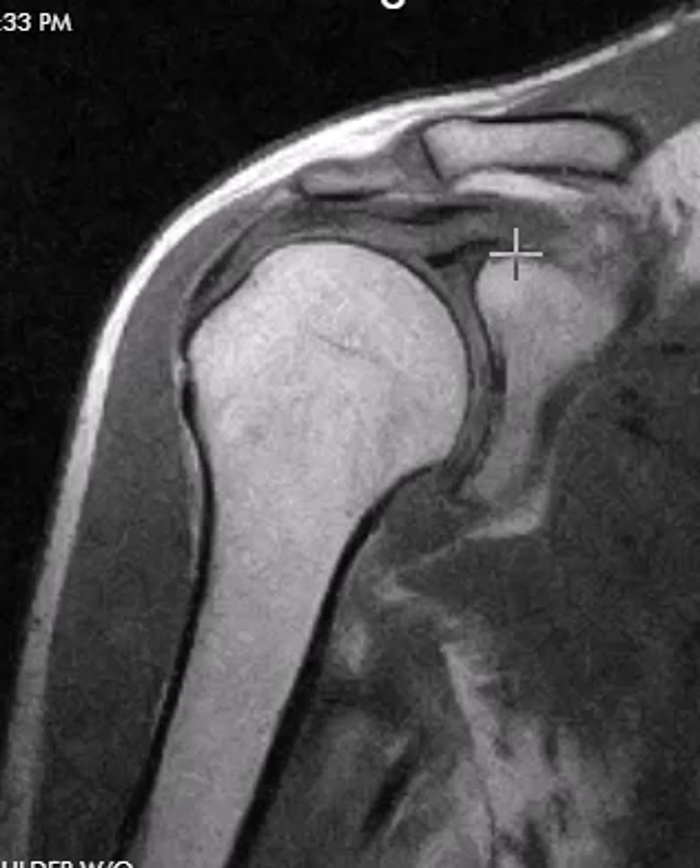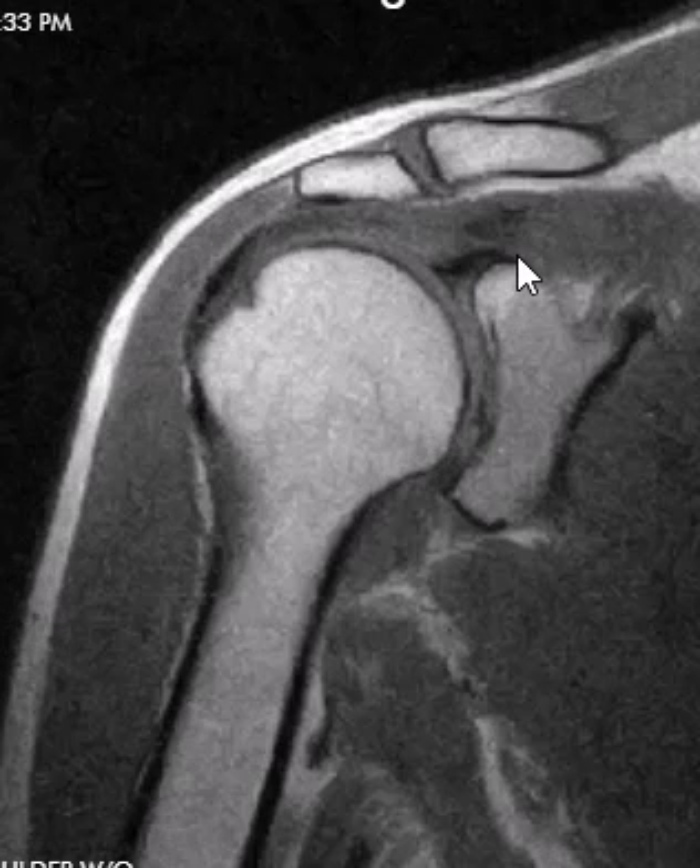If we look above the joint here, we look for the AC joint. If we get this midline cut here, we see just a perfect AC joint. There's no erosion, spurring, or marrow edema. It looks great.